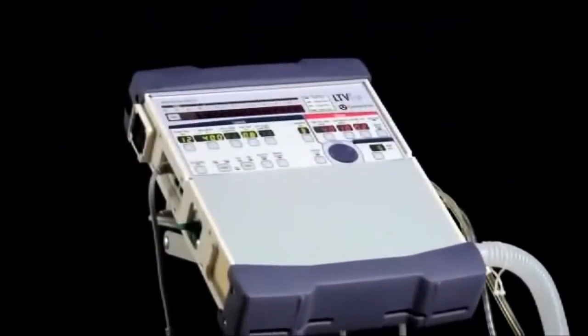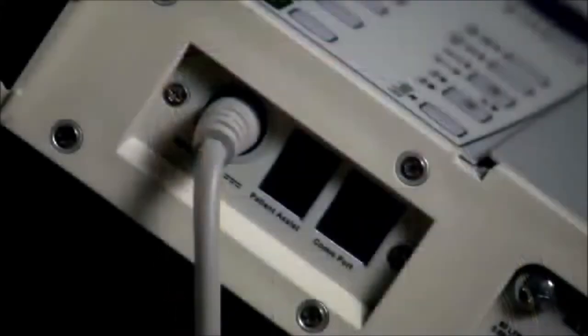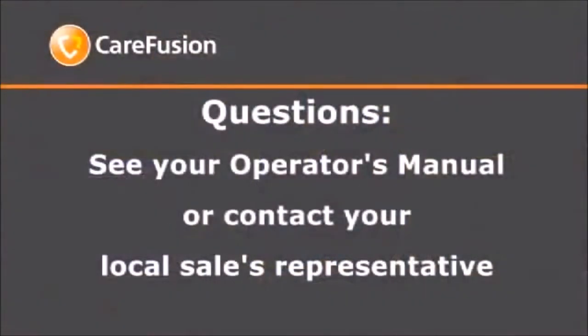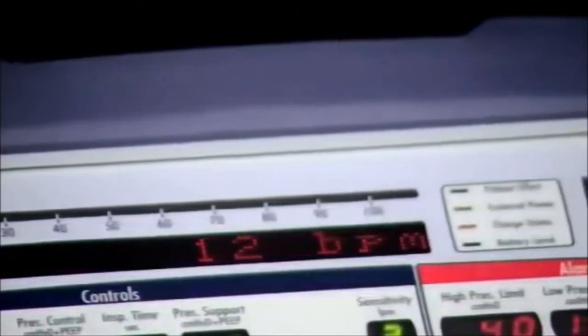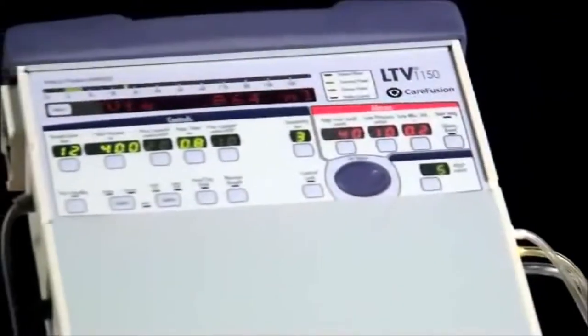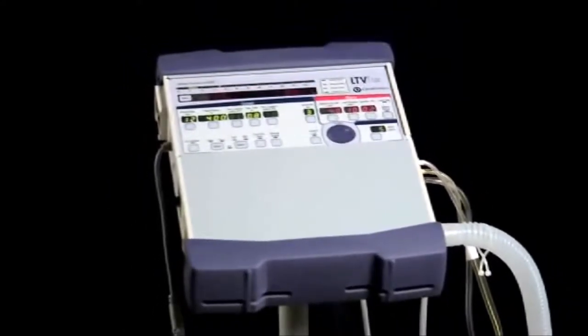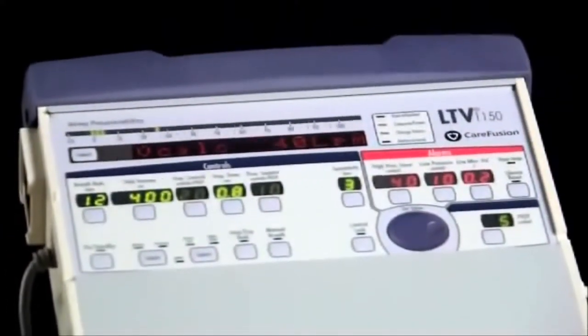LTV stands for Laptop Ventilator. The LTV is small and lightweight, like a laptop computer. It only weighs about 14 pounds but packs a world of innovative features into its small size. If you have any questions, please see your Operator's Manual or contact your local sales representative. Welcome to our DVD training program for the LTV 1150 Ventilator. This training program is intended to familiarize caregivers of patients on the LTV 1150 Ventilator with the use of this life support device. The LTV offers both volume and pressure ventilation. Today, we will be discussing the LTV 1150 in particular.